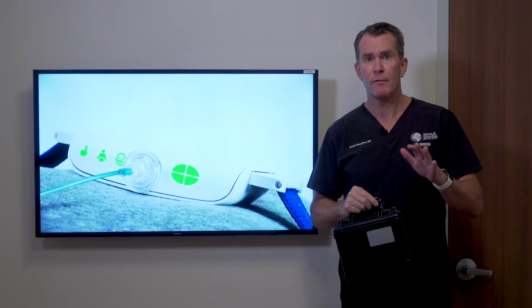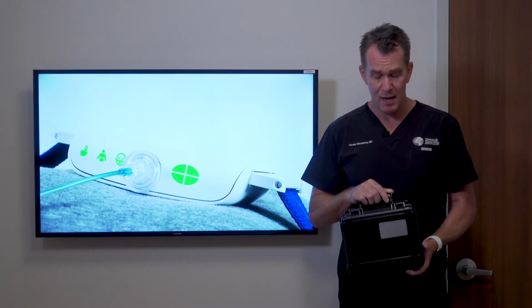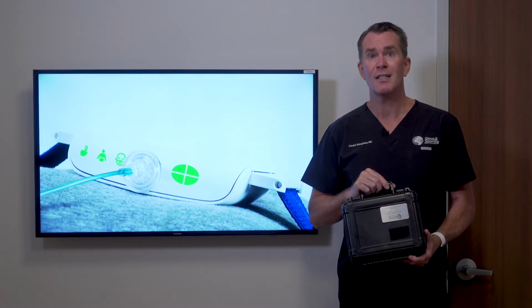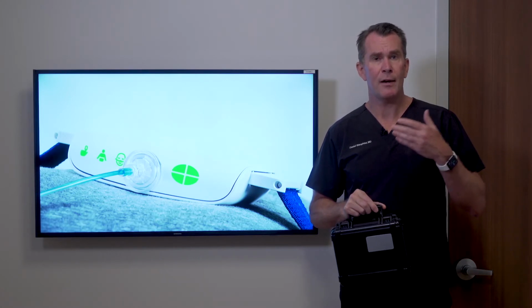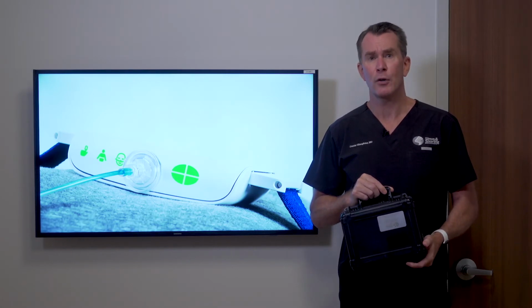Well, we've got phones that fit in our pocket now and great technology, and the same thing holds true for sleep testing. It's now done with a home sleep testing device. Home sleep testing devices are definitely just as accurate as an in-lab study for the diagnosis of obstructive sleep apnea, but you get to do it at home in your own bed with your own teddy bear. It's a natural environment, so in a lot of ways I think it's actually more accurate.